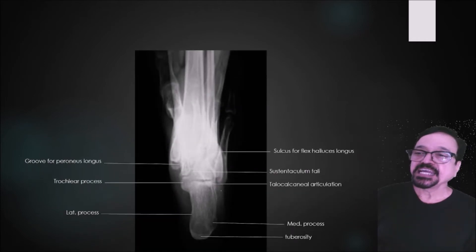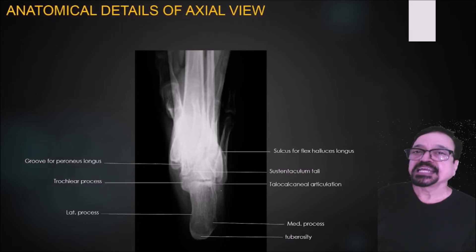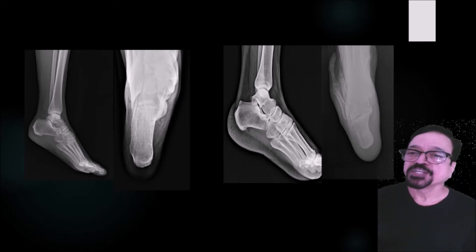The anatomical structures you see are: the sulcus for the flexor hallucis longus, the sustentaculum tali, the talocalcaneal articulation, the medial process, the tuberosity, the lateral process, the trochlear process, and the groove for the peroneus longus. These are important structures and they are visualized well in this projection. We are seeing this in the lateral as well as in the axial projection.